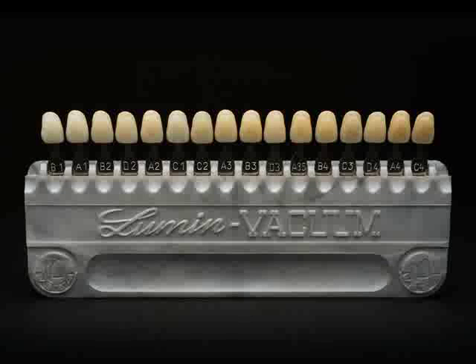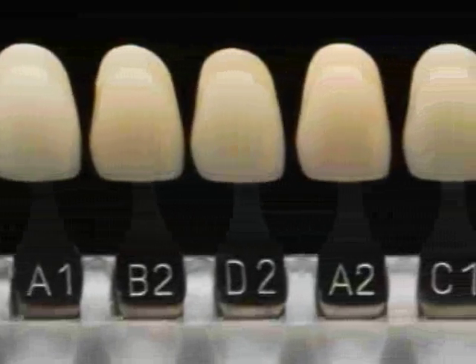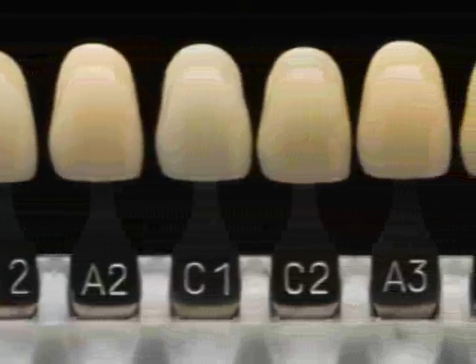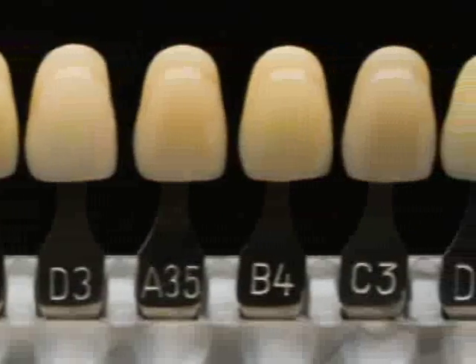Therefore, the final choice should be verified using a second shade guide where the specimens have been arranged according to value rather than according to groups. This guide is arranged with the lightest specimen B1 on the left and the darkest specimen C4 on the right.